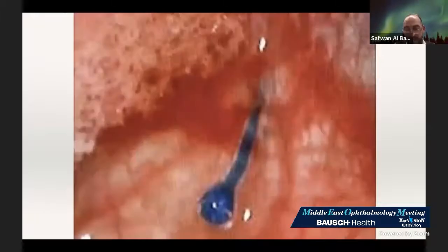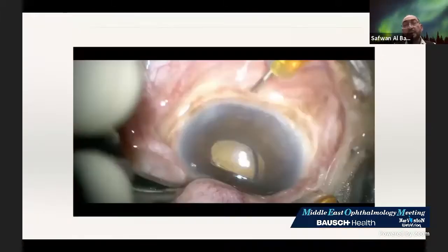Now I will go to the hinge. I will go to the movie without double needle. Now this lens is in, and I decided to scleral-fixate and rescue that lens, and that's the movie of how it works.